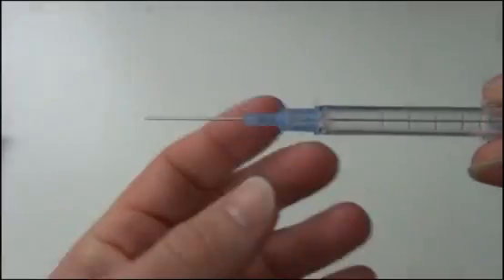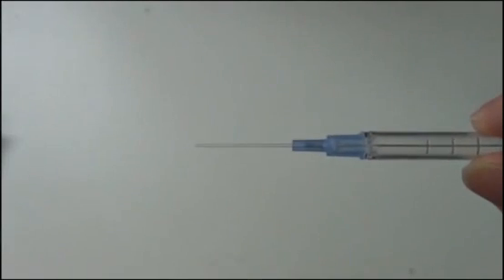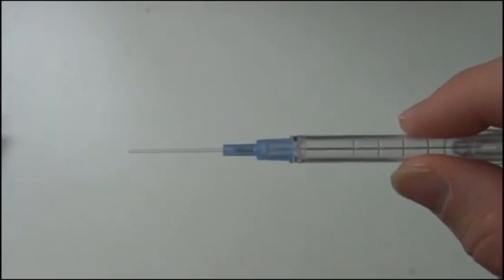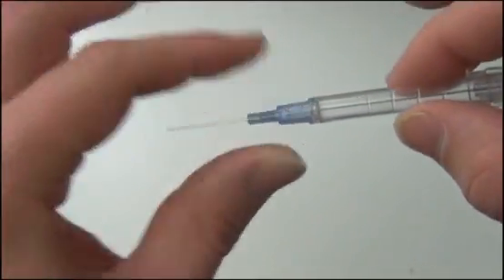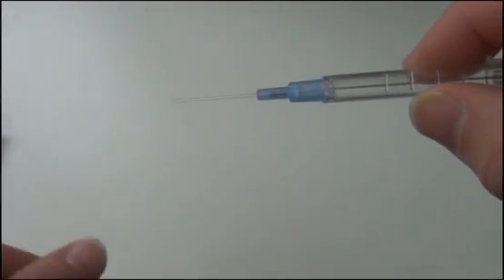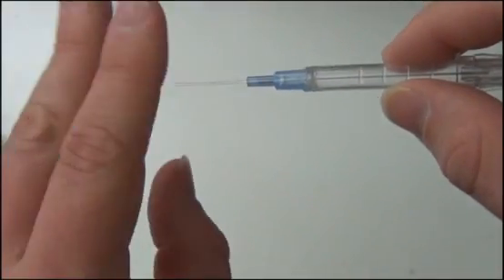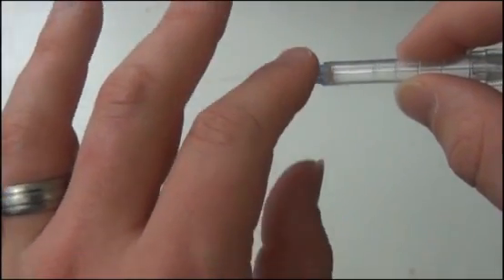As soon as you disconnect this, you're going to have blood going everywhere. Let me just say that's the number one thing that I see nursing students and new nurses do wrong is they disconnect this while they still have the tourniquet on there. If you do that, you're just going to get a whole bloody mess everywhere. So the first thing you're going to do is release that tourniquet, and you can then hold pressure on the vein just above where you have it inserted.